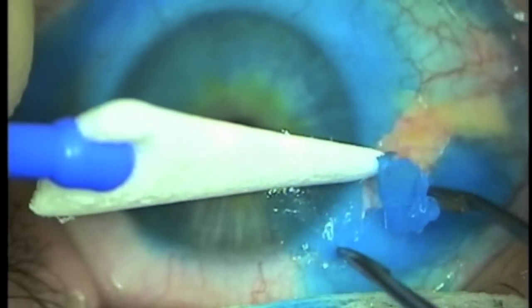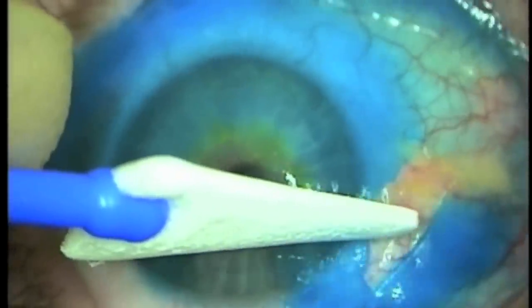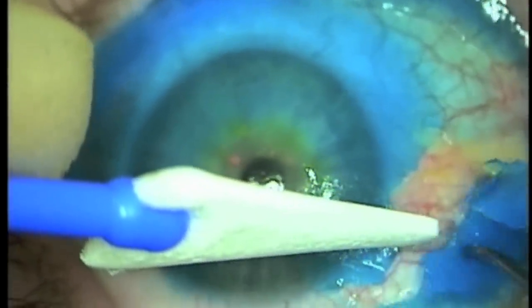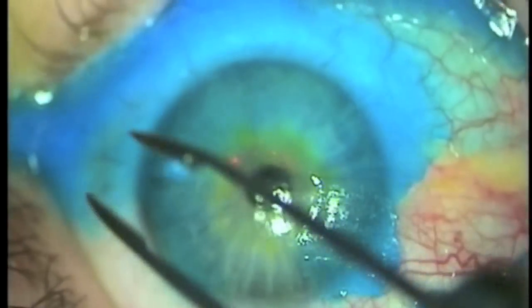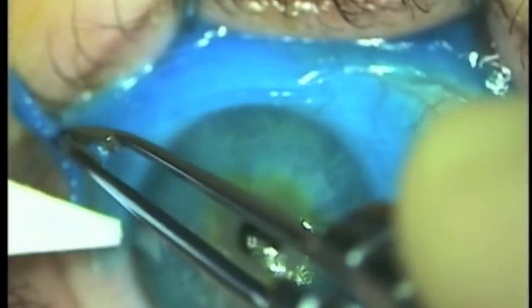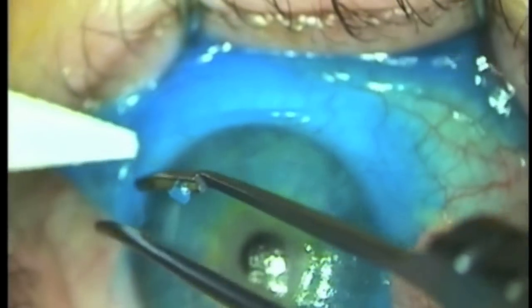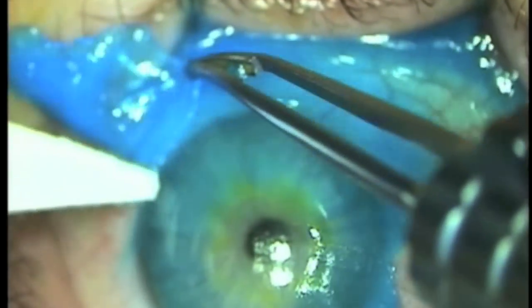First of all, the excess tissue glue is removed from the fornix. By supporting the tissue glue on the cornea, you can tear the excess away from the conjunctiva and fornix. All excess Occucyl is removed from the ocular surface except for the corneal area.